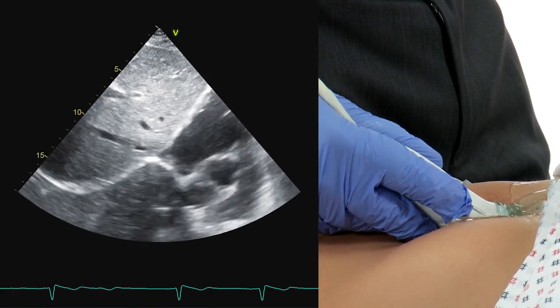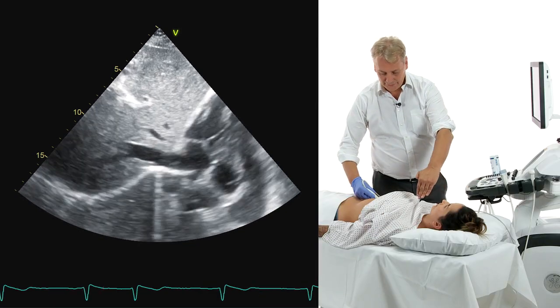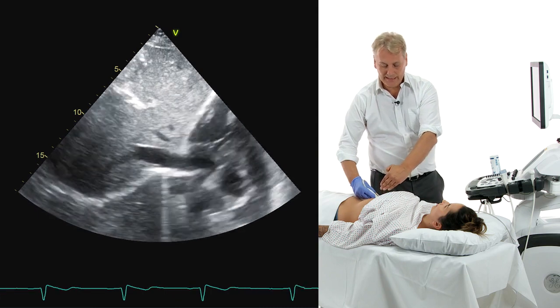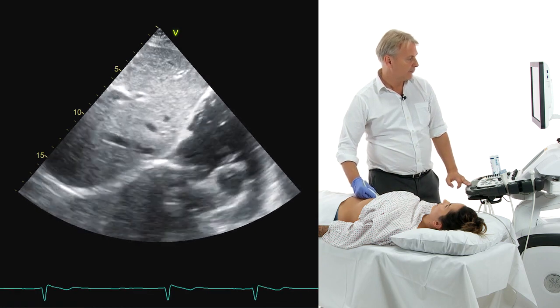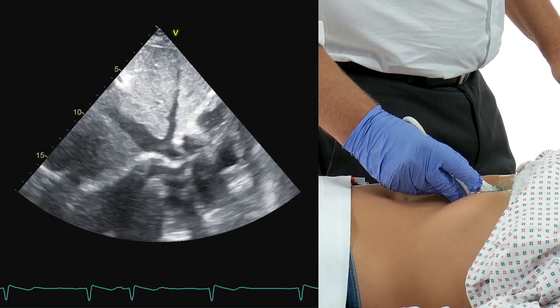enters the right atrium. Remember, we now have an orientation of the IVC which is in longitudinal direction, just as we have the transducer oriented, and we are a little bit more to the right of the midline. Here you see the IVC, and if you move the transducer back and forth a little bit, also the hepatic veins, how they enter the IVC.